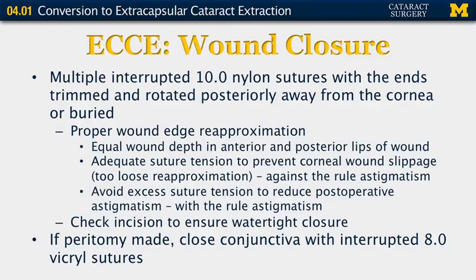For wound closure, place multiple interrupted 10-0 nylon sutures, trim the ends and either bury them or rotate them posteriorly away from the cornea so they don't cause discomfort to the patient. Proper wound edge re-approximation is critically important — you want equal wound depth on both the anterior and posterior lips. Ensure adequate suture tension to prevent corneal wound slippage, which would cause against-the-rule astigmatism, but also avoid excessive suture tension, which would cause significant with-the-rule astigmatism. When done, check the incision to ensure it is watertight, and if a peritomy was made, close the conjunctiva with interrupted absorbable sutures or with cautery.